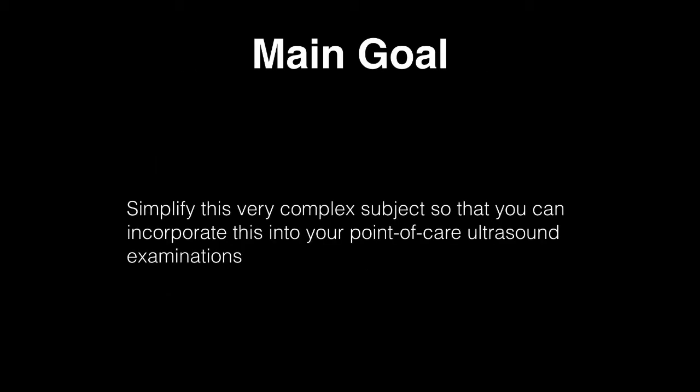Please keep in mind that Doppler ultrasound is a very complex subject, and by no means am I trying to create a video textbook here on the subject of Doppler ultrasound. The main goal of these introductory lectures is going to be to simplify Doppler ultrasound so that you can incorporate this into your point-of-care ultrasound exams.